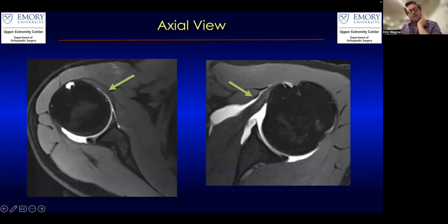First, your different tendons. So you can see your subscapularis. This is sort of the upper part of the subscapularis. This is a more muscular part of the subscapularis. And it's inserting onto this flat area right here. So this is the bicipital groove. This is your lateral humerus. This bicipital groove, where that little circle thing with the biceps, right next to that bicipital groove is your lesser tuberosity, and that's where this subscapularis should be inserting or should be connected to.